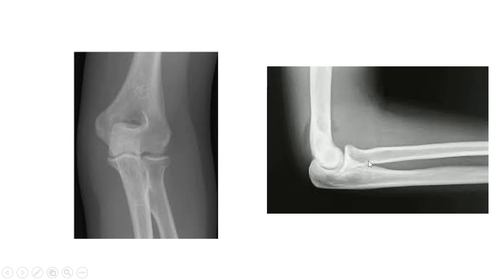Now here this is the superior radioulnar joint, which is a pivot variety of synovial joint. At this joint, the supination and pronation movements occur. This is the interosseous border of the radius, and this is the interosseous border of the ulna.